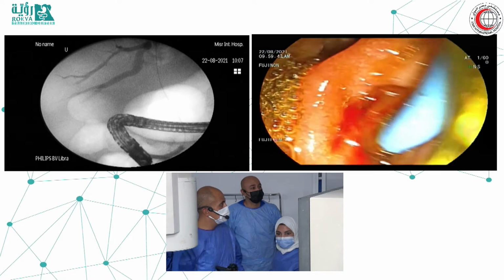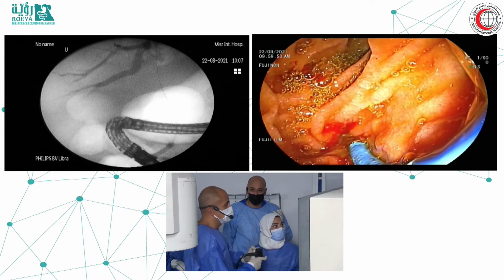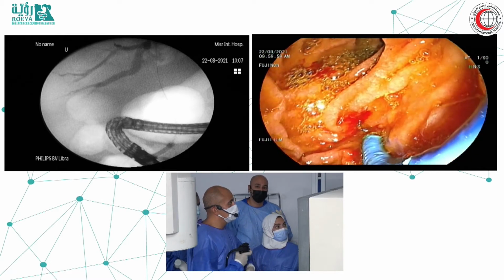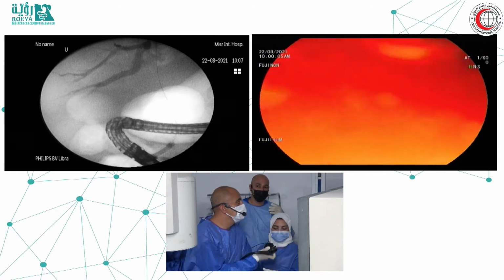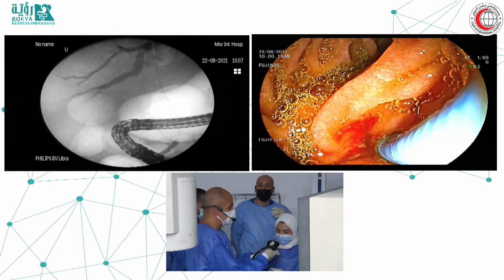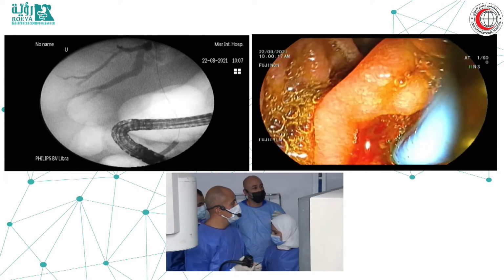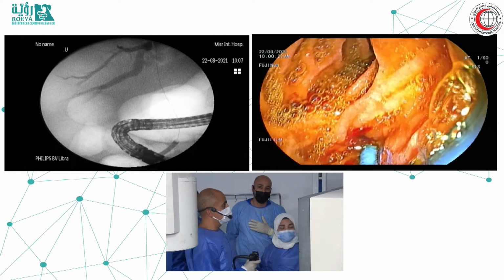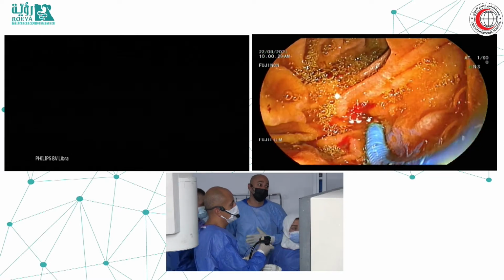So in my experience, yes, I do have an impression, but it's not as accurate, and I wouldn't even say that it reaches 90% accuracy. I have to be honest. I think we are still far from having an accurate diagnosis. I mean, we're far from reaching the level that we've reached in the colon, for example. In colonic polyps, we can really assess with the pit pattern and so on, and with NBI, you can visually assess. But in SpyGlass, at least in my experience, I'm never confident enough with my visual assessment. I'm not sure about your experience. And do you feel that artificial intelligence... Yes.